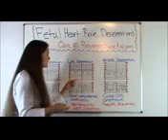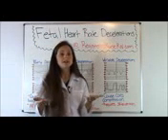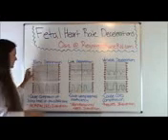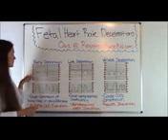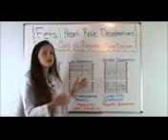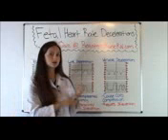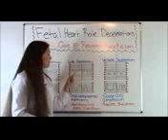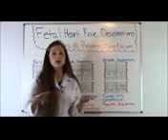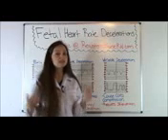So that's causing that. The way I remembered it in nursing school is that I remembered it as an upside down U. I knew it was different than early because it's mirroring. It's like a mirror. You flip the mirror and it absolutely looks like mom's contraction. So I knew it wasn't early, but for late it wasn't mirroring. And in order to differentiate if it was early, late, or variable, I memorized that it was a U. U means it was caused by uteroplacental insufficiency, so I knew that it was late deceleration. So that's how I remembered that.